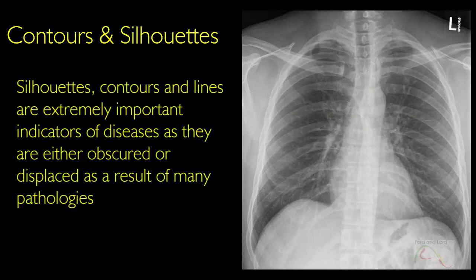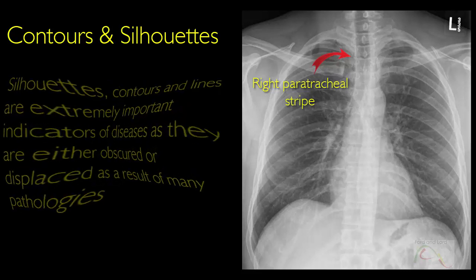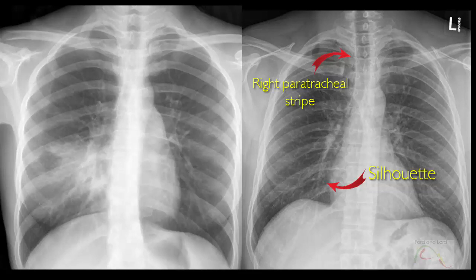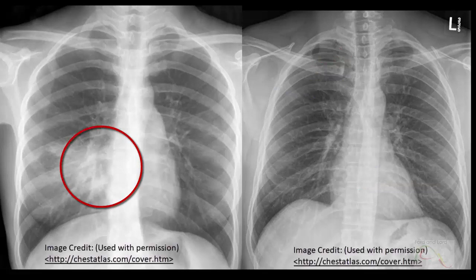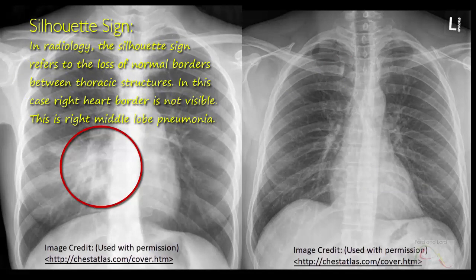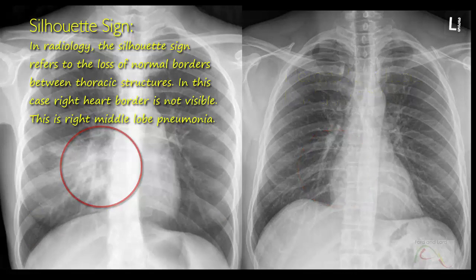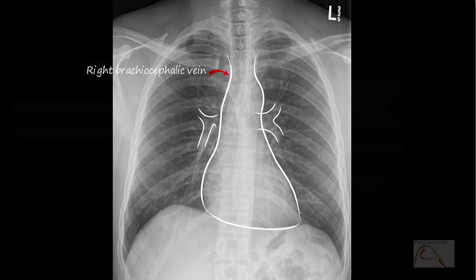Soft tissue and lung interfaces are seen as either lines or stripes — for example, the right paratracheal stripe — or as a silhouette, such as that found between the right atrium and the right middle lobe of the right lung. By definition, the word silhouette means a dark shape seen against a light surface. Loss of these interfaces indicates the presence of lung pathology. For example, loss of the interface between the right heart border and the lung may represent right middle lobe pneumonia. These silhouettes and lines are extremely important indicators of disease, as they are either obscured or displaced as a result of many pathologies. Consolidation in the right middle lobe has obscured the right heart border — this is right middle lobe pneumonia. You should know these contours by heart.